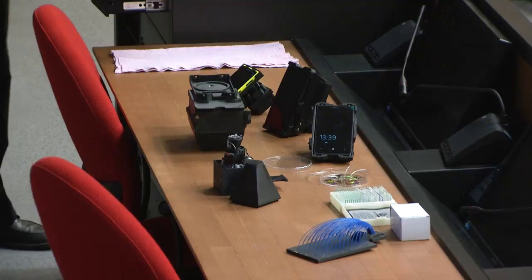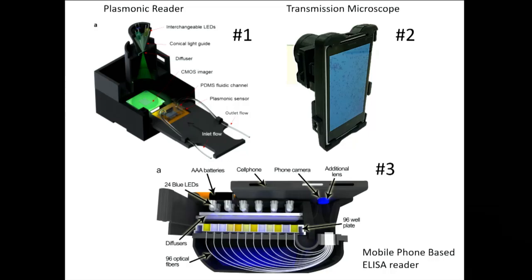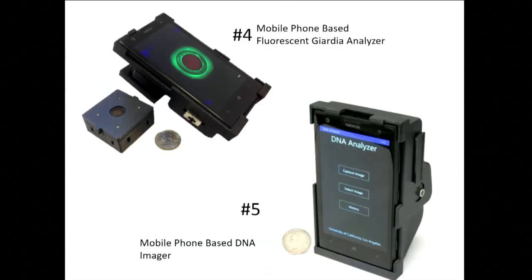The third device is a mobile phone-based ELISA reader. This is one of my favorite projects in the lab because ELISA is a test that's done all over the world. It's very common in clinics and labs everywhere. And this is a device I think can really have a lot of impact. So would love to talk with you about that. And I have some slides detailing this more. And then the fourth and fifth device are the Giardia analyzer and the DNA analyzer, that I talked about in the presentation before the break.